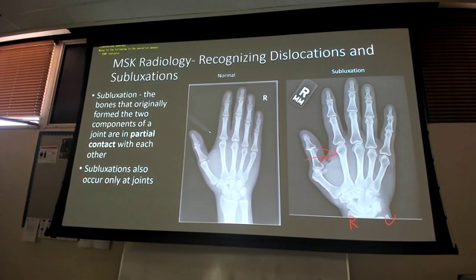Real quick, sir, you're still going to get your break, I just want to clear this topic up before we break. You will give us orthogonal views if you give us something on the examination, correct? You're not going to make us guess dorsal or ventral. If I were to give you this and not give you orthogonal views, I can't ask you to tell me dorsal or ventral because I did not supply you with that image and that information. But I can give you something like this and expect you to find the subluxation, which bone it is, and name it for ulnar versus radial based off of something like this. But no, I cannot add in dorsal and ventral on just this picture because I did not give you enough information.